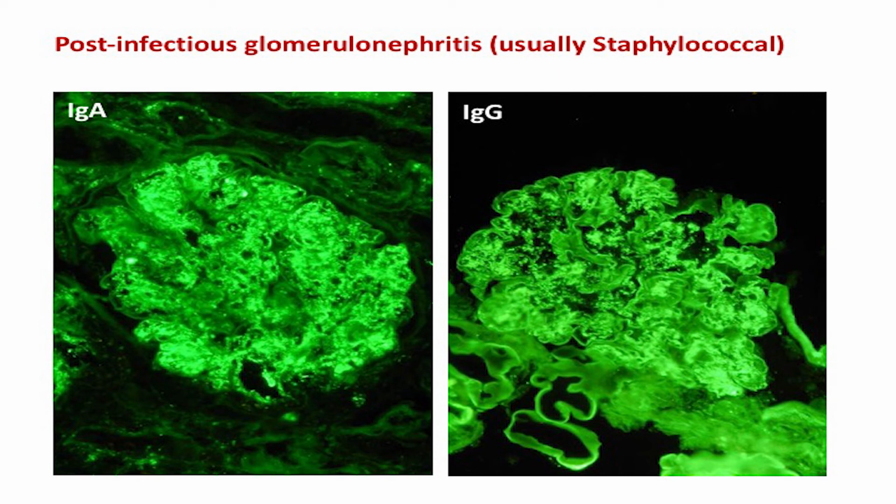This patient was diabetic and had an infected ulcer on their foot. And the pathologist can take great delight in these cases in picking up their nephrologists: on the basis of the renal biopsy, tell the nephrologist what bacteria is growing in that foot ulcer, because it's virtually always, in this case, Staph aureus and usually MRSA.